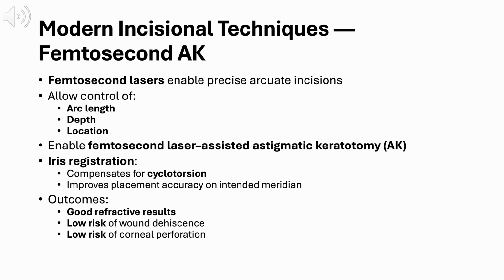Clinically, these advances translate into good refractive outcomes with a low risk of complications. The precision of femtosecond delivery reduces the risk of wound dehiscence and minimizes the chance of corneal perforation, making modern incisional techniques both safer and more predictable than earlier approaches.